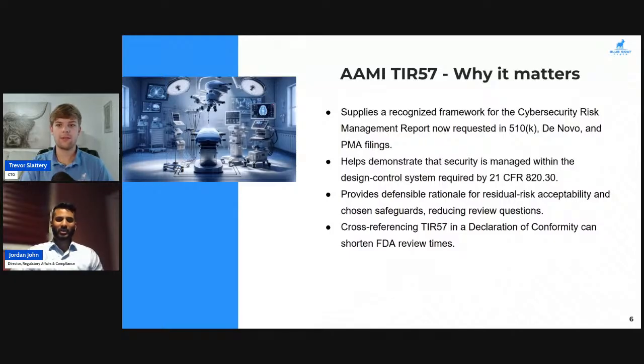Absolutely. And I think it's in a sense no different than all the other frameworks, in the sense that you need to start early on. You need to implement the risk analysis and risk assessment process right at the start of your design process. So again, it's not an afterthought. It's not something you come to at the end when you're about to submit to FDA and try to figure out your risks and risk assessment.